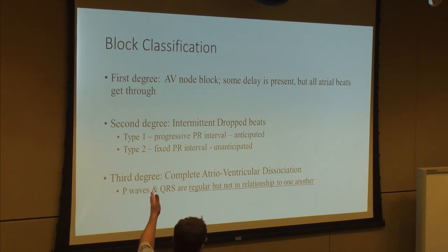So block classification, just a quick review, right? First degree, second degree, third degree. Here's what they look like.